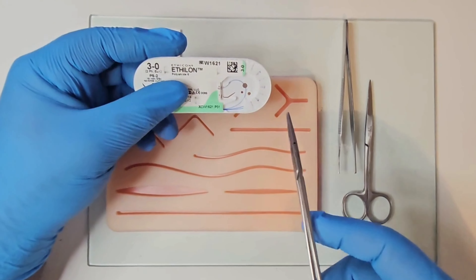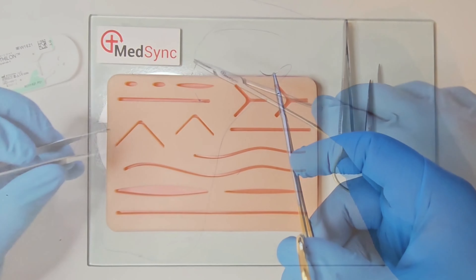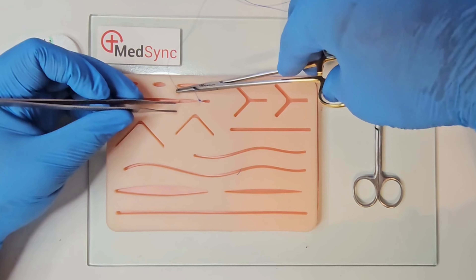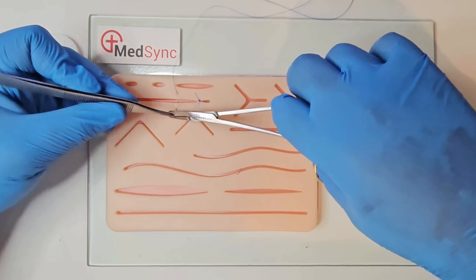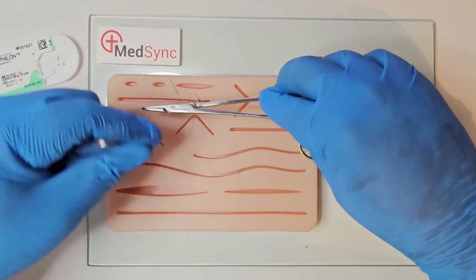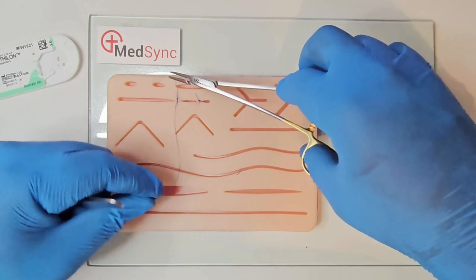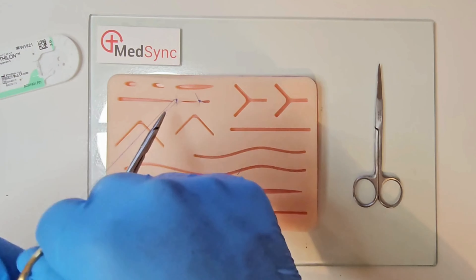You can mount the needle in the packet two-thirds along the body. Keep the needle within the surgical field and pull the packet away. Enter the skin at 90 degrees; the hand rotates from prone to supine. Stabilise the needle with the forceps and retrieve the needle out of the skin with the needle holder. With your left hand, pull the suture through. Wrap the suture around the needle holder twice and pull the short suture through.